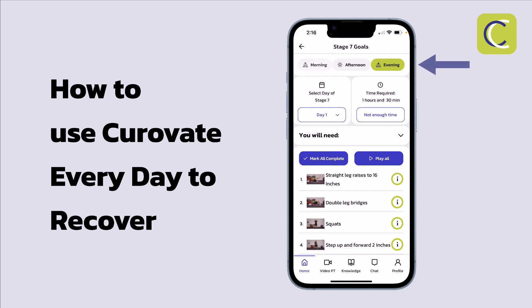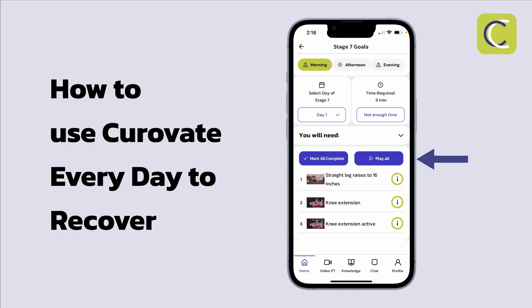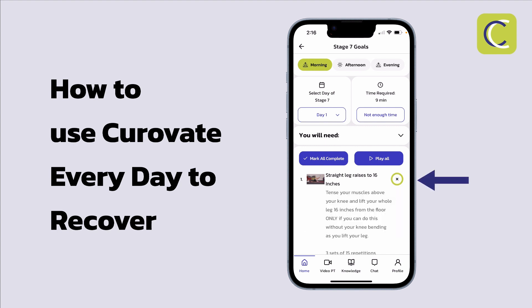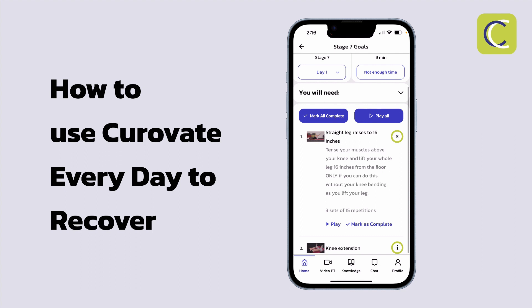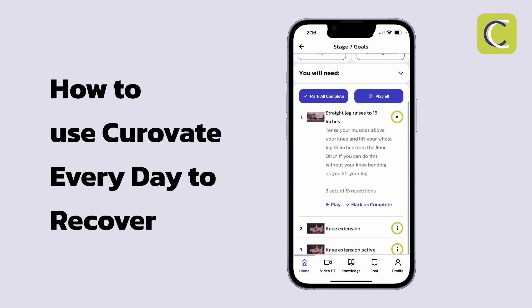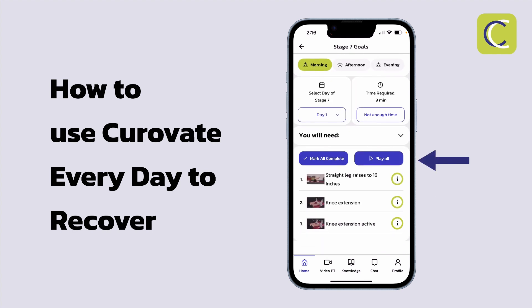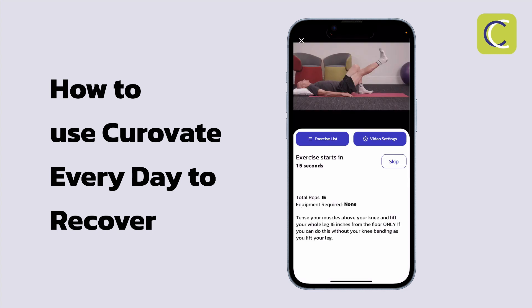Every day when I come into my exercises, I open up the morning session and press play all to view all of my exercise videos. You can also have a quick glance at an exercise by pressing the i icon, where you can see a description of the exercise, the number of repetitions and sets, and you can mark it as complete or play the video. In our case we're going to press play all to run through all the exercises within this particular stage.